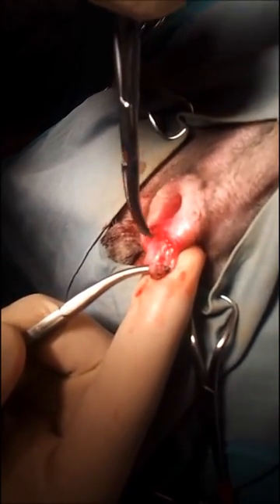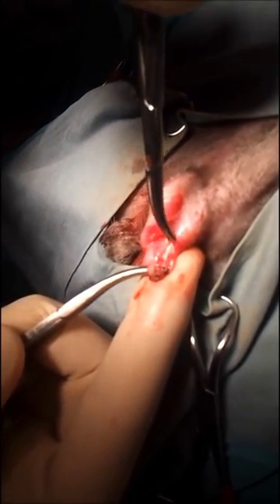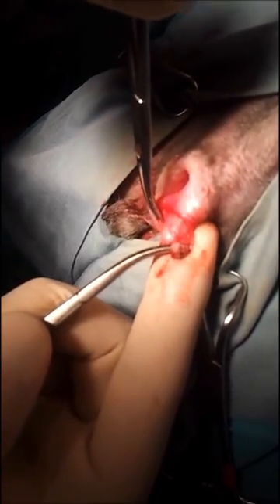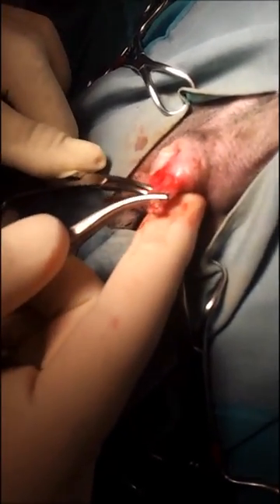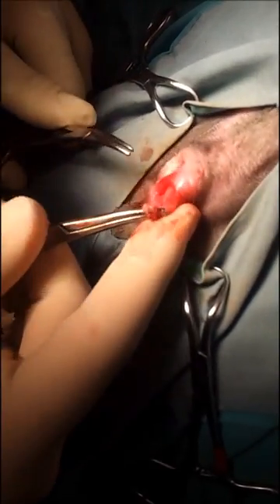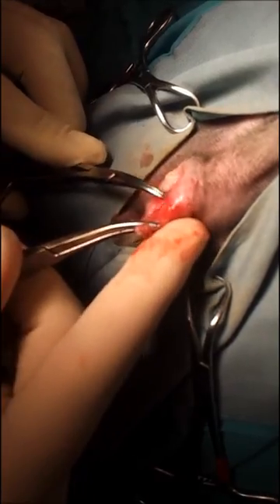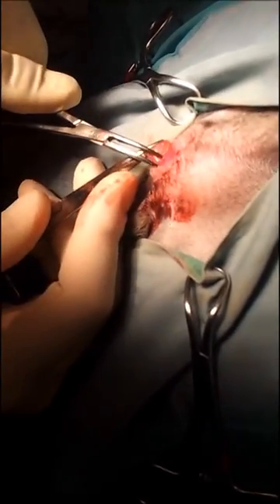When it starts ripping away, I tend to let go — I don't want it to rip hard. As soon as it releases, I let go and see what I've done; I can always go back to it. One thing I teach my students who shadow me is to try and keep your elbows in if you can, using more of your wrists. The position of the patient is pretty important to make it easier on your back but also easier to do the job.